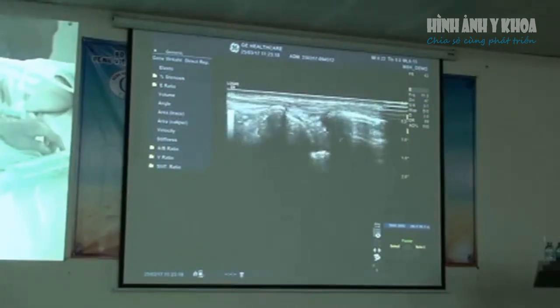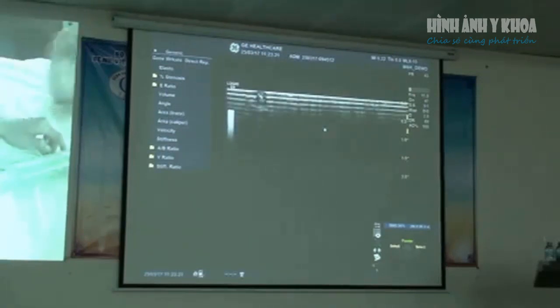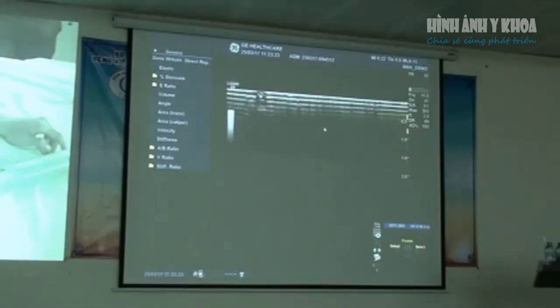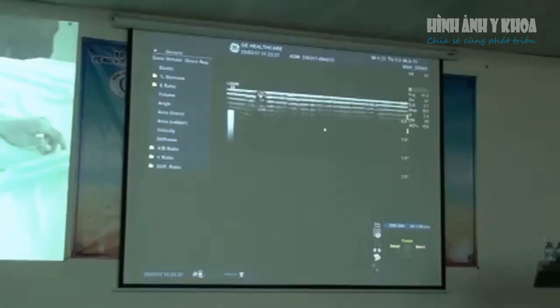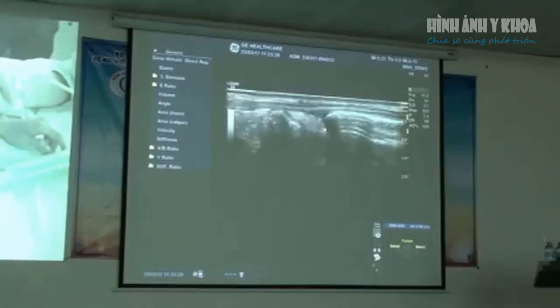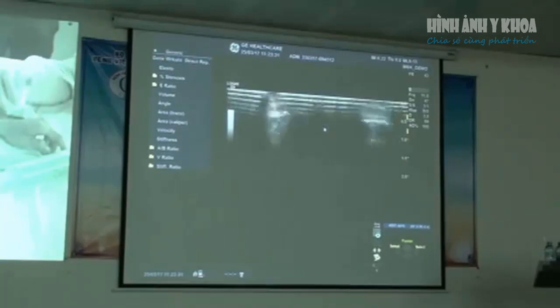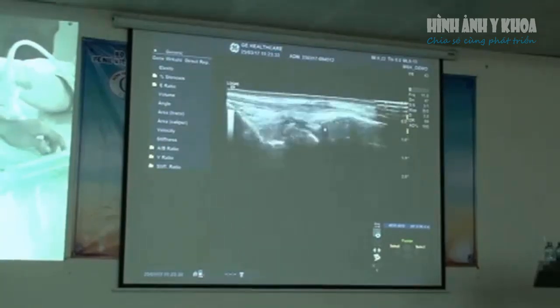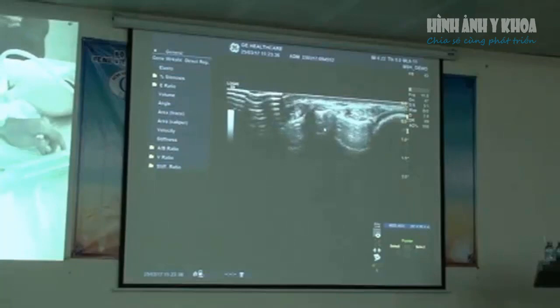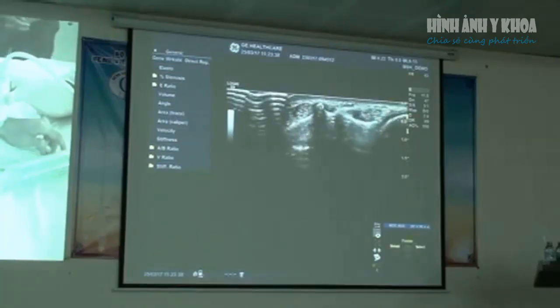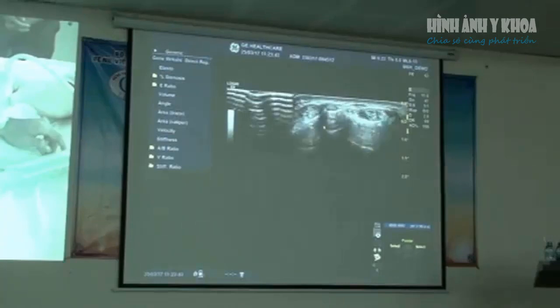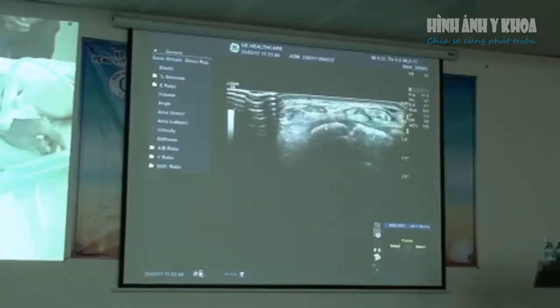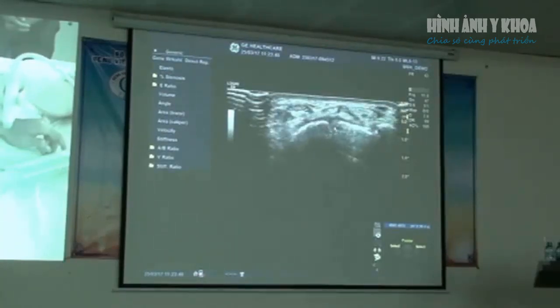If there's a defect in here, normally the patients are able to point directly on where they're sore — they do a one-finger test right on where they're sore. On the dorsal aspect again, if we find Lister's tubercle just here, and then if we slide towards the fingers, this is the scapholunate ligament just here.